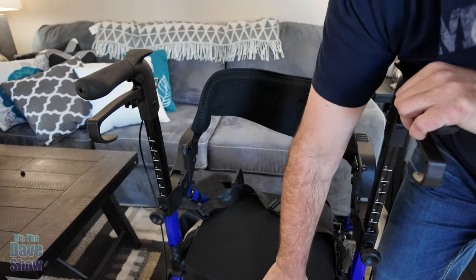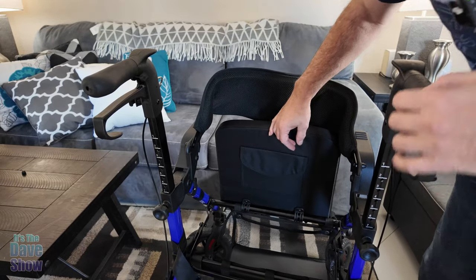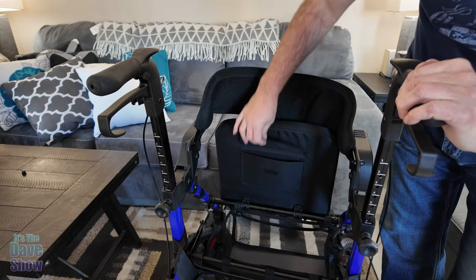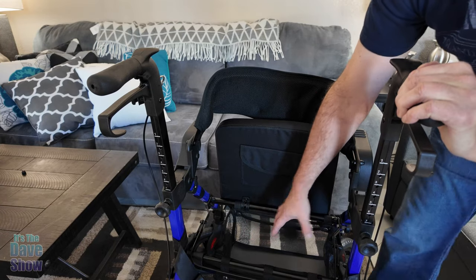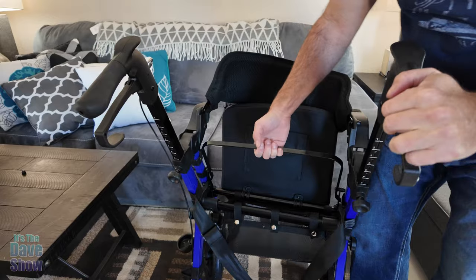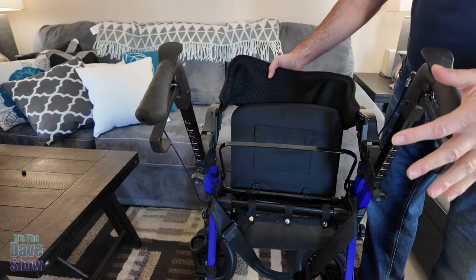The chair is also foldable. Lift up the seat and there's a little hidden pocket underneath, which is kind of cool. There's also a nice little basket underneath that you can take off. Grab the center bar and pull up to fold the walker for easy storage.